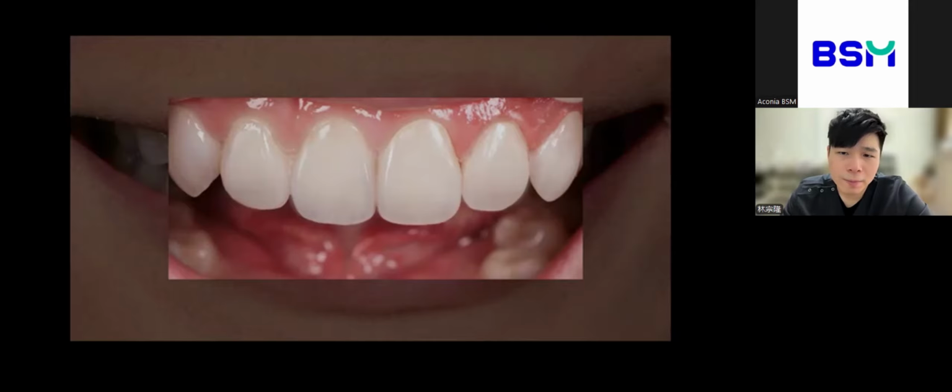One of the biggest differences between zirconia veneers and glass ceramic is how the translucency behaves. Glass ceramic is a quartz-based, uniform material. The translucency is pretty much the same from cervical to incisal, right? But zirconia has a cubic crystal structure, so it naturally forms a gradient of translucency within the material.